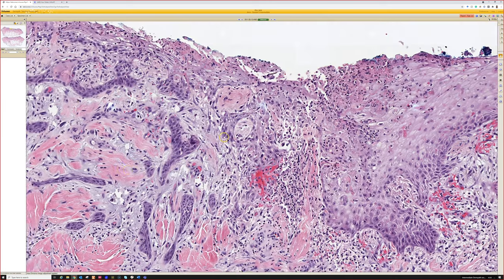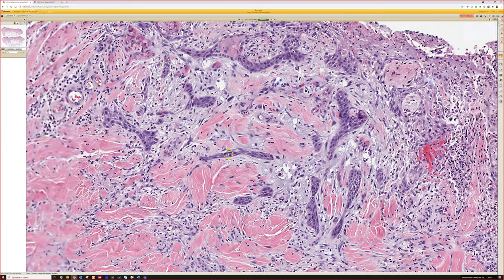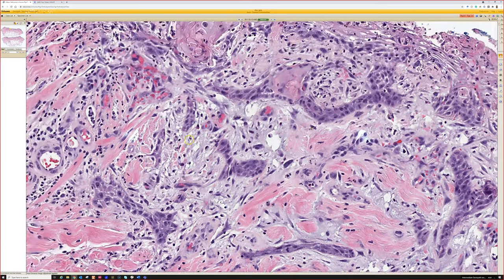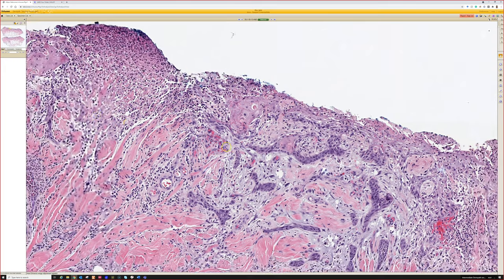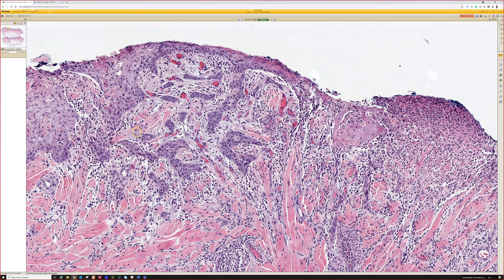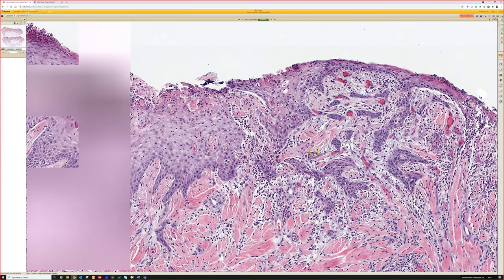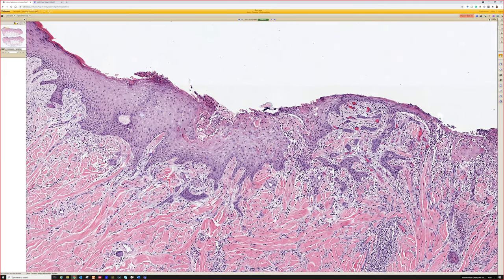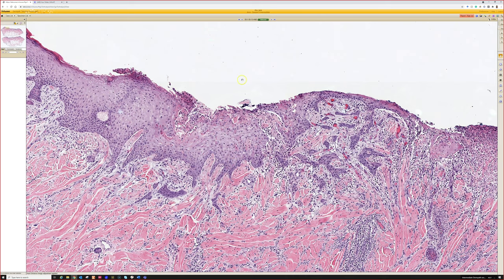So anyway, study it when you know that it's not a squamous cell carcinoma, and then it'll help you when you see this. And look, there's a mitosis. Oh my gosh, no, it's fine. It's benign. So I find reactive versus neoplastic to be a challenge sometimes in practice, even after almost a decade of doing this. And so I think you can never study it too much, because sometimes it will really save you being very good at that and having a lot of experience with looking at reactive versus neoplasm.